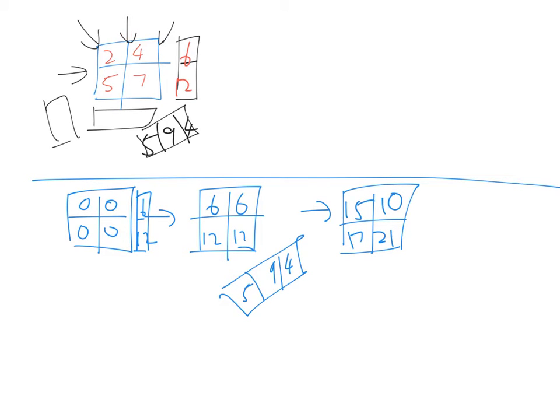Okay now. Then they rotate again. So they rotate again, so now you send here and you detect here. So what will the detector detect? The amount that has been absorbed through these two, which is 7. And how much has been absorbed through these two, which is 11.